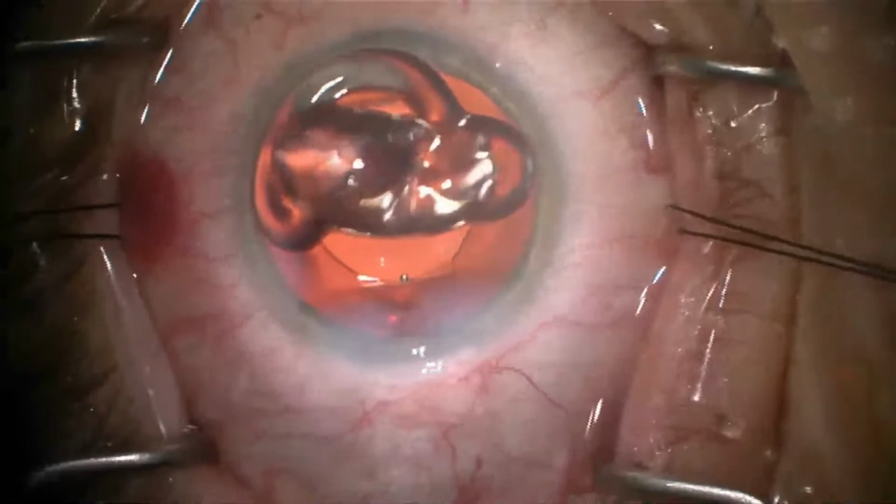Putting viscoelastic on the cornea, and then I like to rotate the head about 25 degrees or so, and the scope as well, 25 to 30 degrees, to give ourselves a nice view of the entire angle with our gonio prism. And this is probably the most important part and probably the most important learning curve: finding that good view. Here I am not able to see the angle very well.